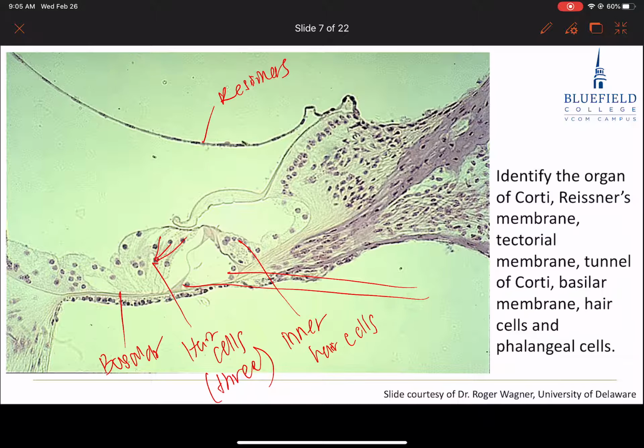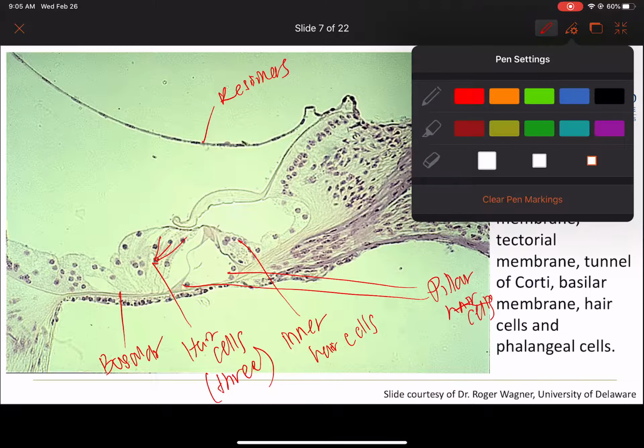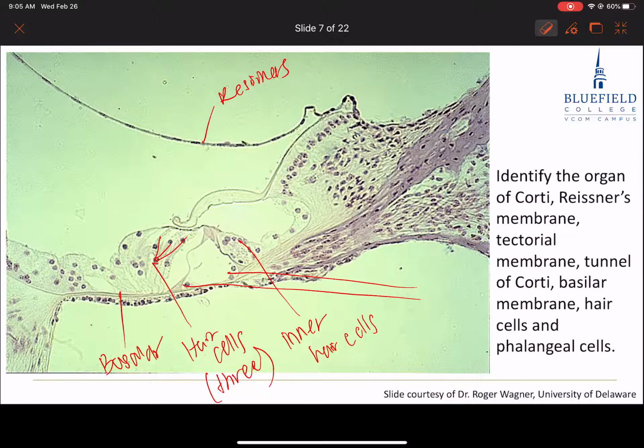How do you differentiate the hair cells on the right side? The upper left is one of these two. It's going to be the superior one, but those are awfully close. There's only one on that side. With a microscope I can find two on occasion, but I can't distinguish that here, so I won't ask you that. I'd have to have an image where I can see it to ask it.